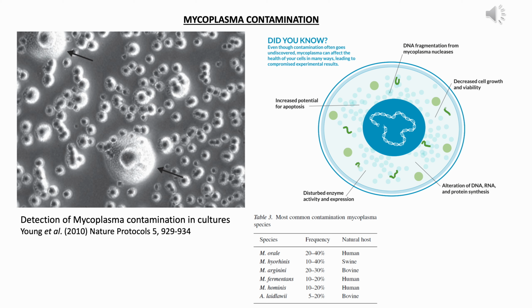Or maybe earlier you had something at 1 micromolar working perfectly fine, and you know that 1 micromolar is inducing your protein by tenfold or causing cell death or whatever experiments you are doing. Maybe early on 1 micromolar is working, but now after 6 months, when you have established everything, you are seeing that 1 micromolar is no longer working. You have to increase it to 10 micromolar to get the result. So which tells us that something happened.